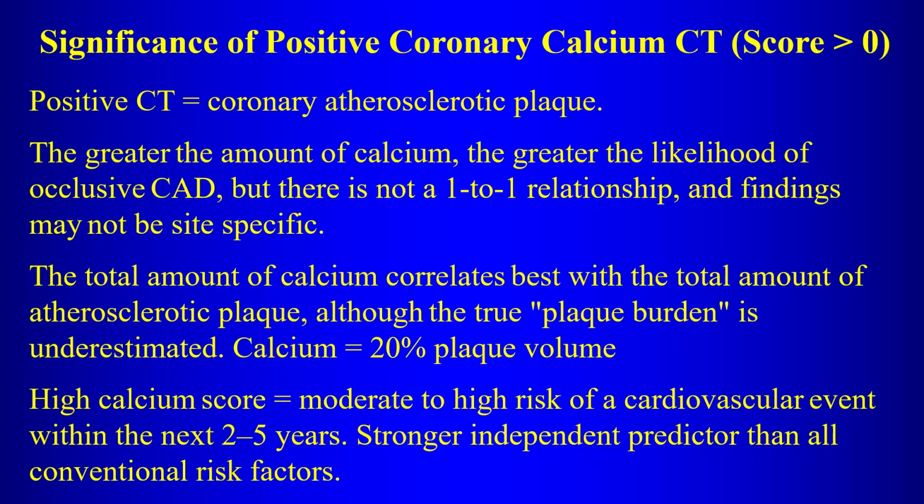It does not mean that the area where you have the most calcification correlates with the region of the stenosis. So this is not site-specific. The total amount of calcium correlates best with the total amount of atherosclerotic plaque, although, as we've said, the true plaque burden is underestimated, as calcium only makes up about 20% of the plaque volume.